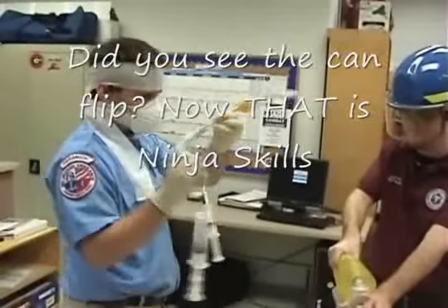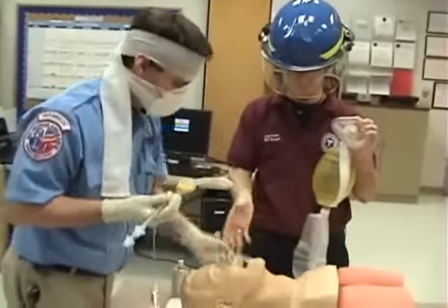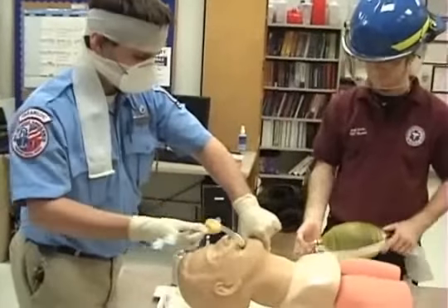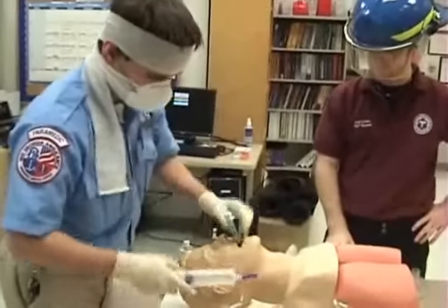Okay, once we're ready, I'm going to instruct my partner to stop bagging. We'll remove the OPA. We will do a tongue-jaw lift, just like we're grabbing a fish. Insert the device, and put it in until the teeth are between the two black lines.